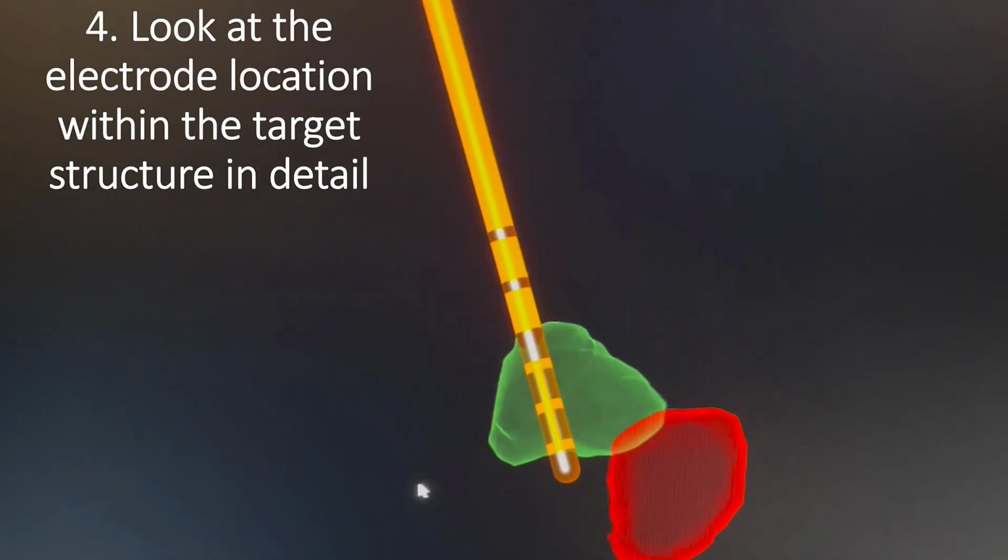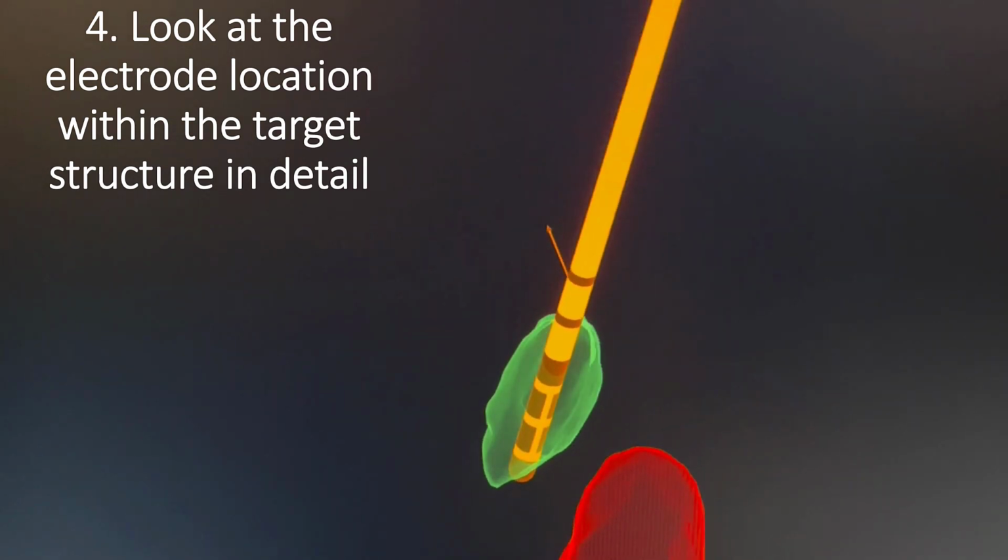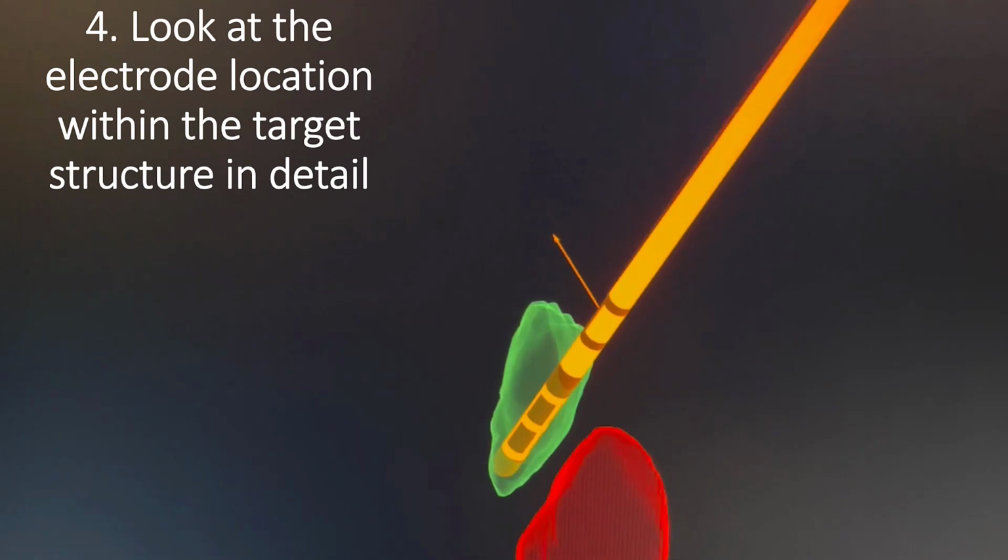We then look at the electrode and location of the individual contacts within the target structure in detail.